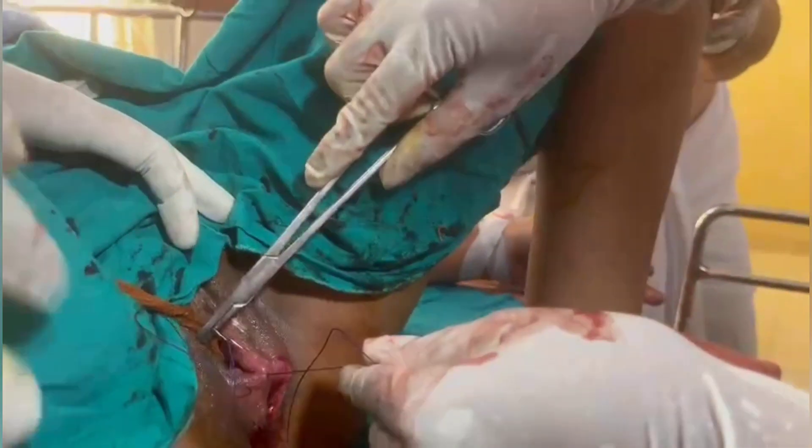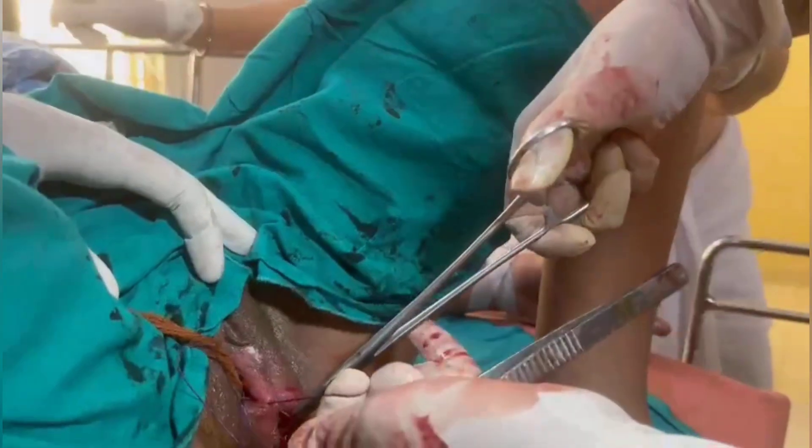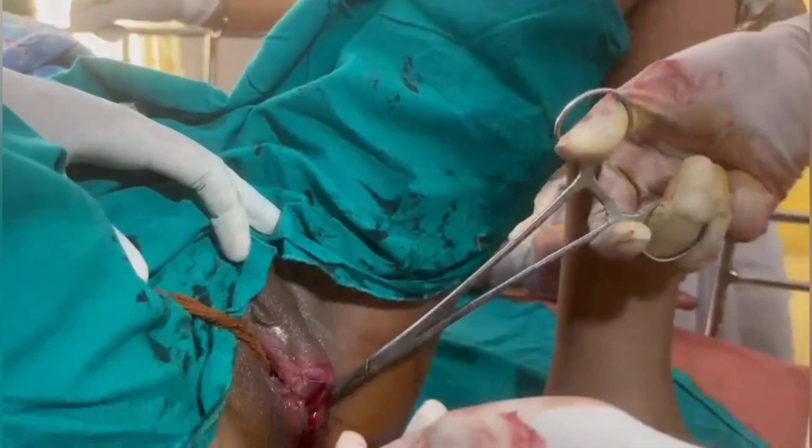A suture is taken, then going inside out, because we are suturing continuously. It's a three-layer continuous suture, so inside out.